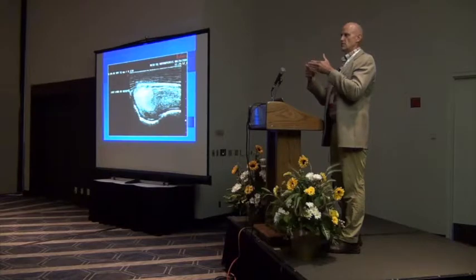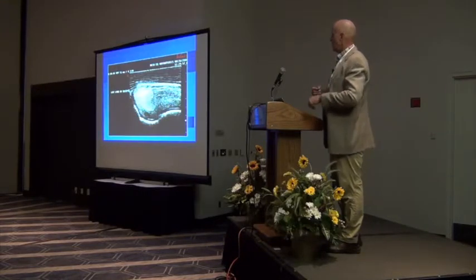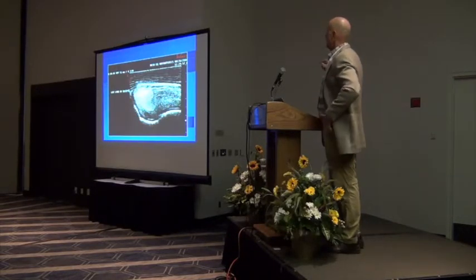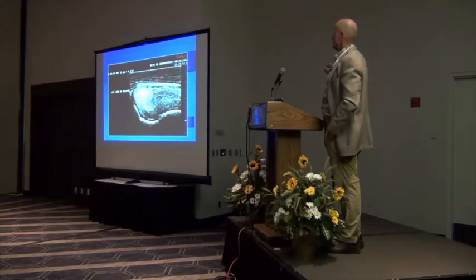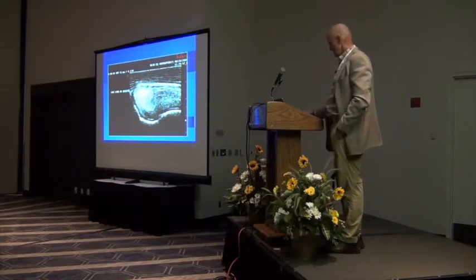Now the unfortunate thing is you don't always know where it ends up, but you can scan back and forth to see that little hyperechoic area. And I will frequently do a transverse view here just to get an idea where I want to stick my needle, and then I'll rock it up in longitudinal and watch it go down into that fluid pocket.